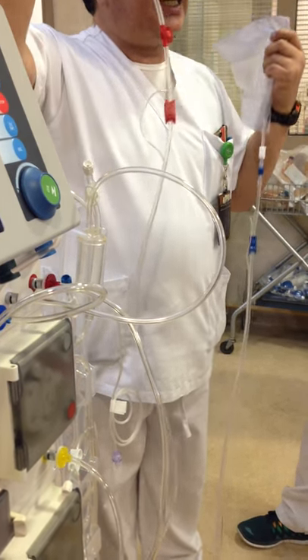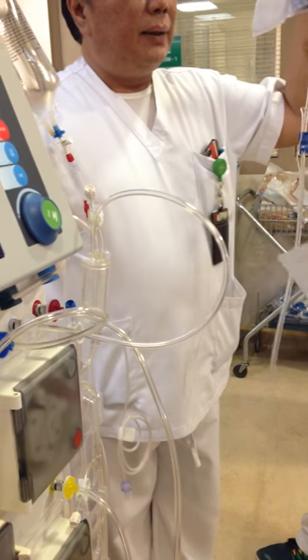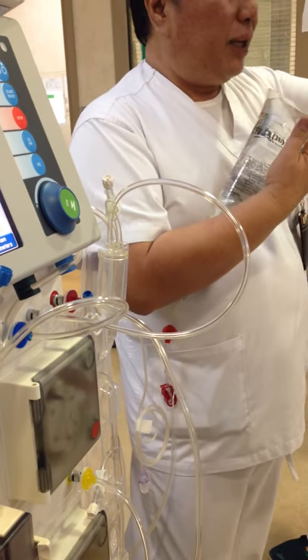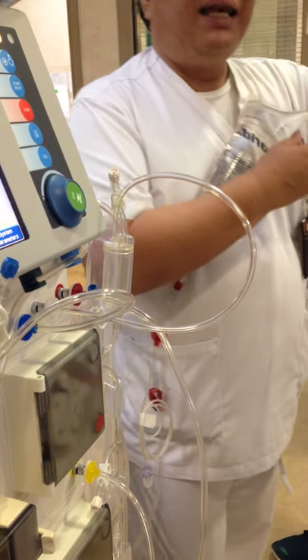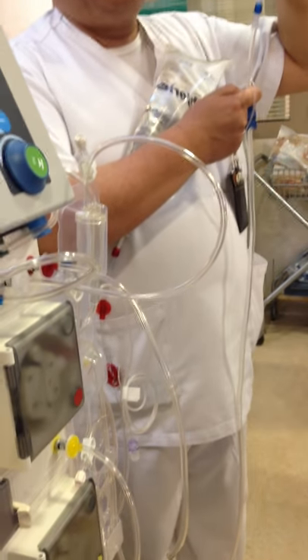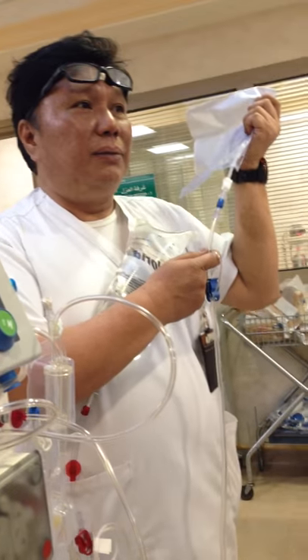You know where the citrate is integrated, you know where the calcium is integrated. As the blood goes to the patient, before it goes to the patient, there's no calcium because it's been chelated. So you need to replace the calcium. Correct? Yes.